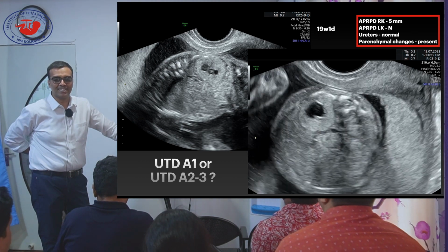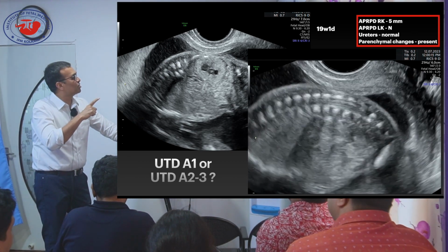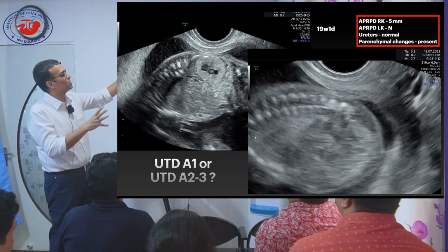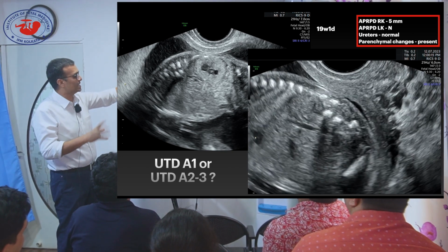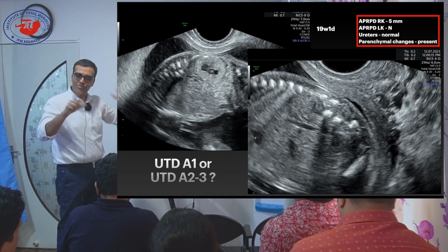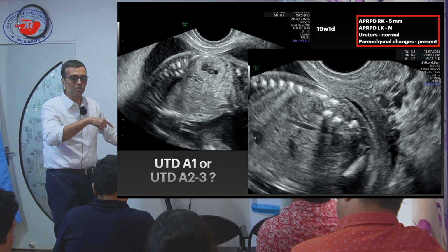It is present. So he has rightly pointed out that one is normal, and there are other clips also, but I have just put 2 clips. So I have looked into detail with all this, and as you have told, abdominally also I have checked it. That is a good idea. Abdominal also I will put here.